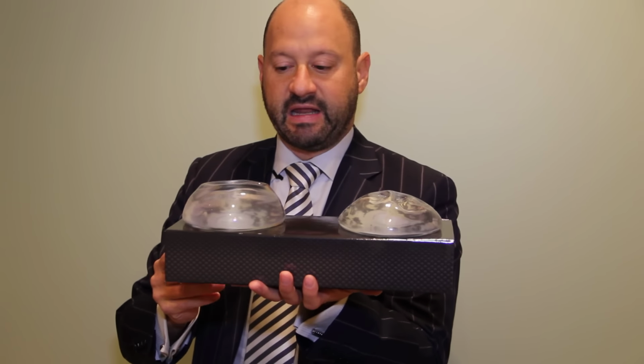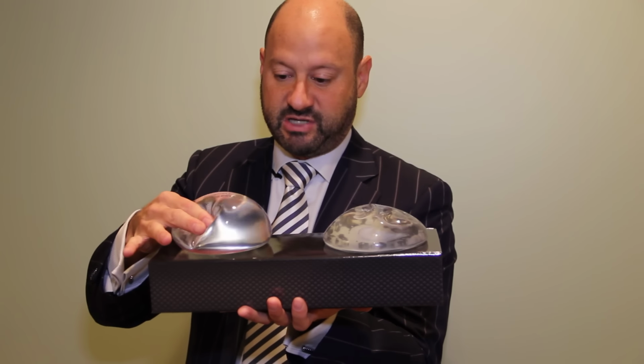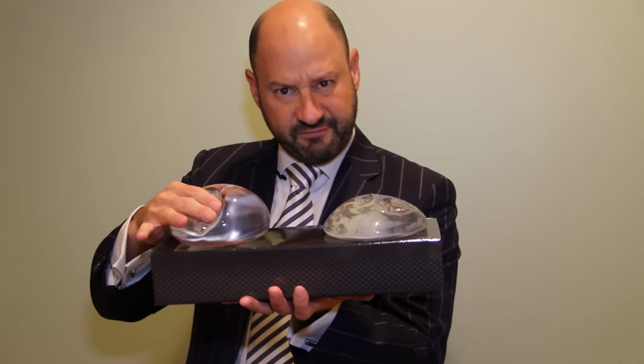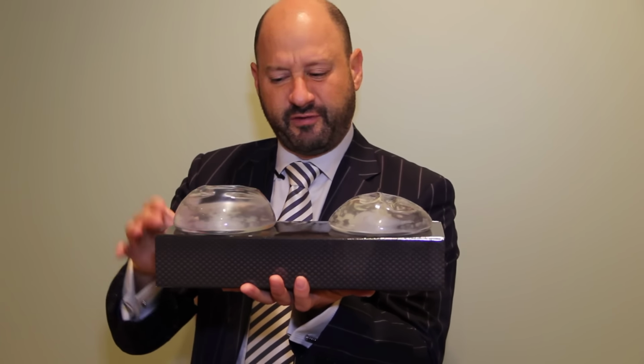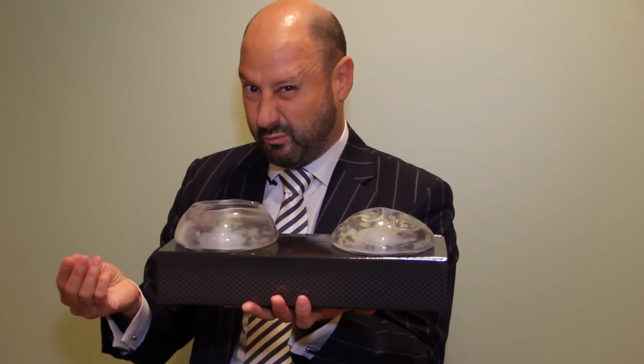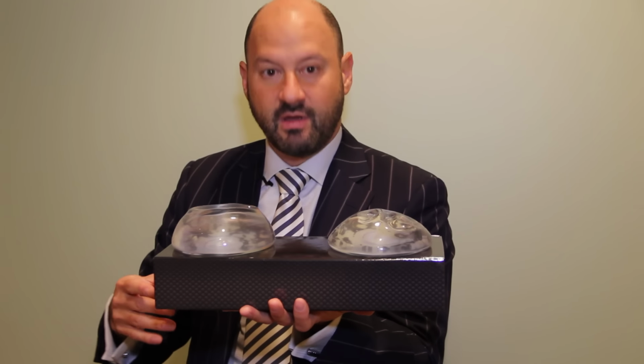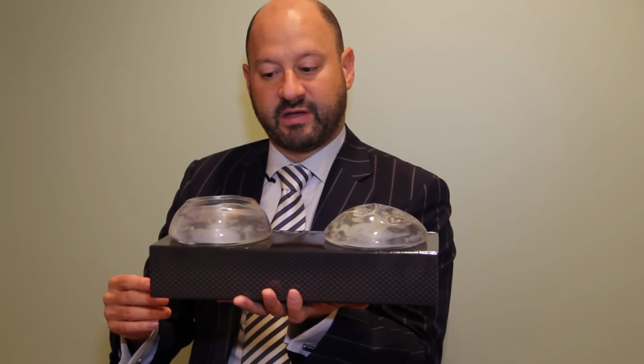These implants here are what we call gel implants, or cohesive gel implants. Most of my patients prefer these implants. In fact, almost all my patients are getting this type of implant because it feels more natural. When you go to feel it, it feels more like a breast. The saline implant, which we also offer in my practice, you can feel, but with those you can feel the implant a little more easily. Maybe you'll feel ripples or see ripples if you're real thin. And so that's why so many patients really prefer these.